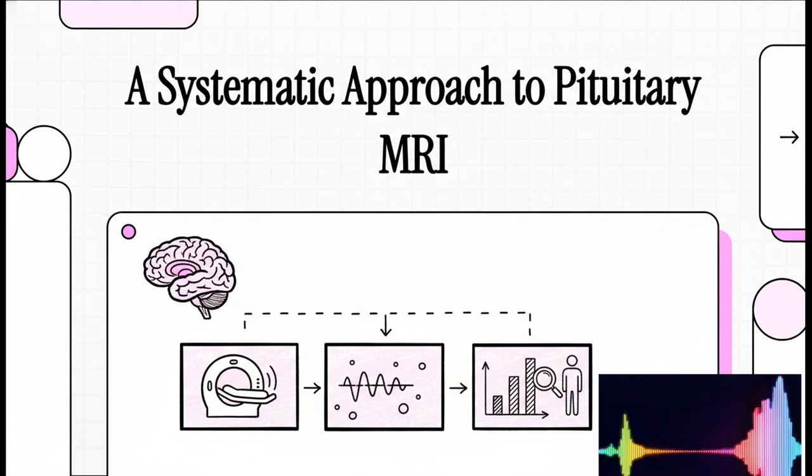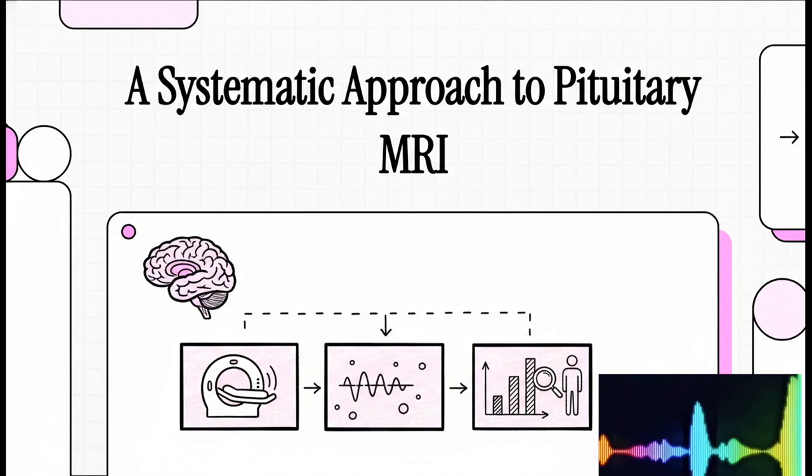This is a practical, step-by-step guide to reading these scans. We'll cover everything from the basic imaging protocols right up to using population-specific data to really lock in that diagnosis. Okay, let's get into it.